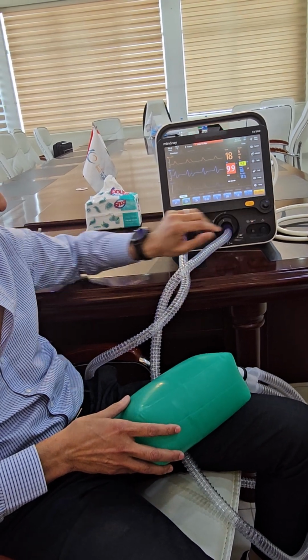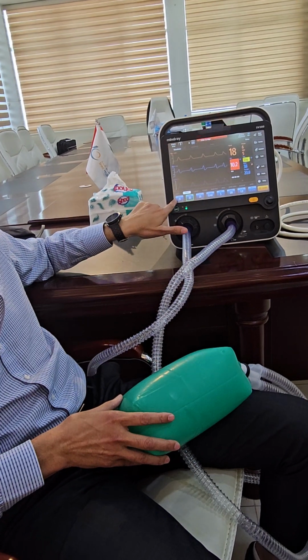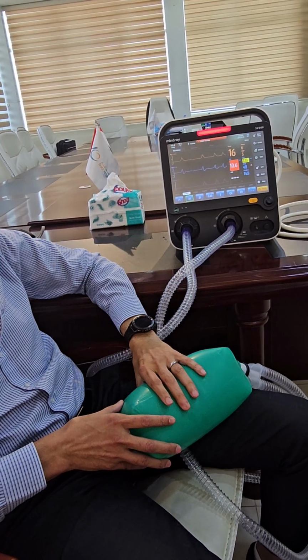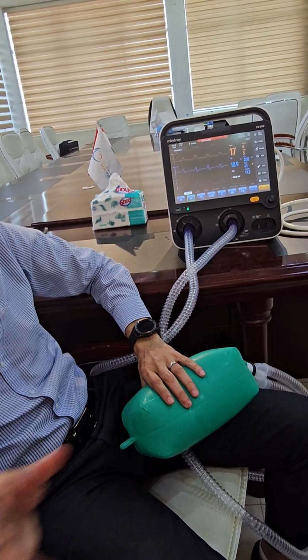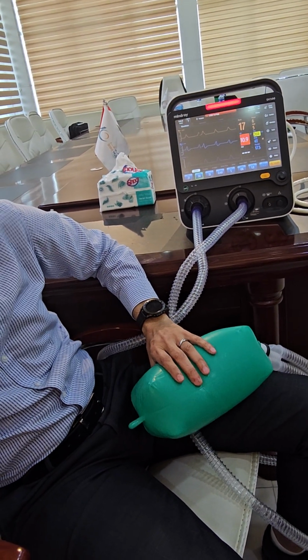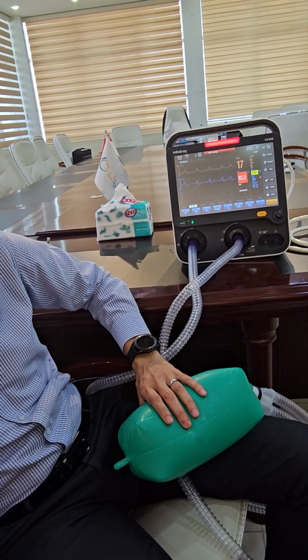So let's say, this is the room air. What is the starting room air? This is the FiO2, the oxygen percentage. What is the starting? Always room air, 21%. Why do we start with 21%? Because Allah created us in 21%. Oxygen is toxic. We don't have a scavenger.